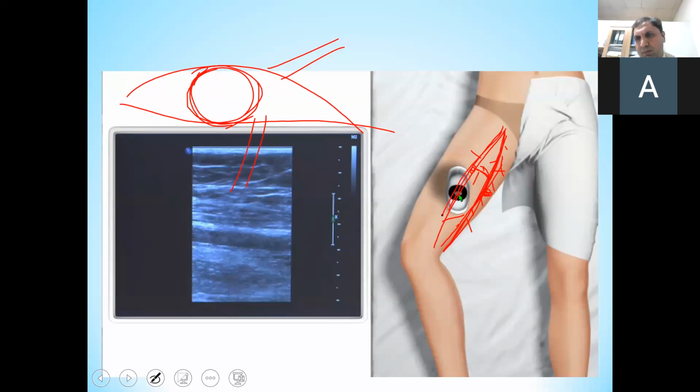from place to place, but preferably it should be evaluated at the adductor canal, making room for access at the shortest distance between the venous and arterial system, the femoral artery and vein, and your transducer, by gently sweeping your transducer to take access while avoiding the huge bulk of the adductor muscle.